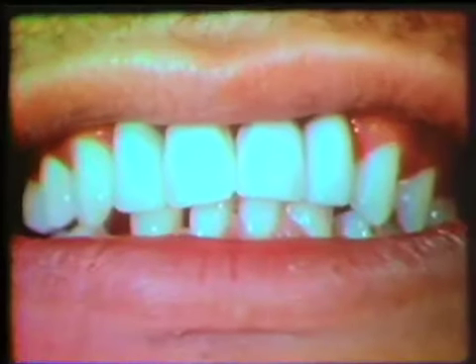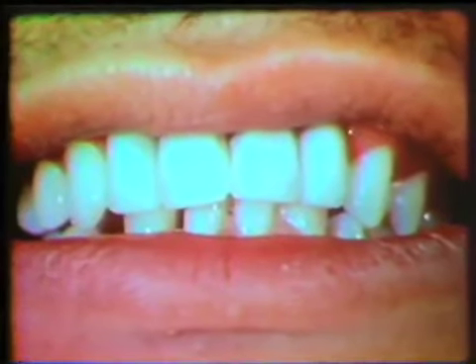While viewing the patient with the completed denture in place, the advantages of such a design can be presented. These include improved aesthetics, since the anterior clasps are eliminated, minimal tooth preparation as compared to that which would be necessary for a fixed restoration, minimal tooth coverage, ease of oral hygiene maintenance, since the appliance is removable, and a reduced chance of distortion, since the retentive components are rigid.